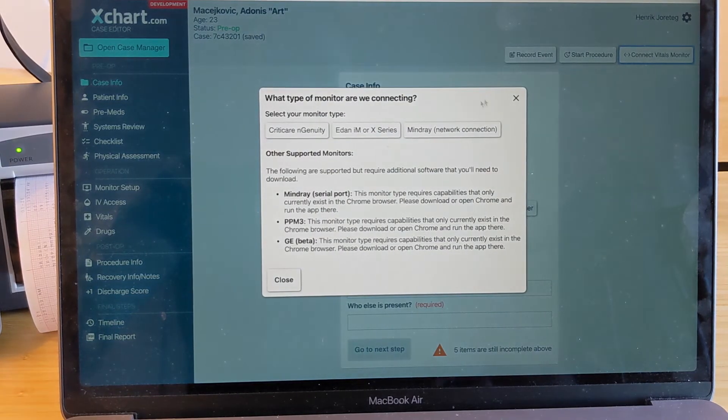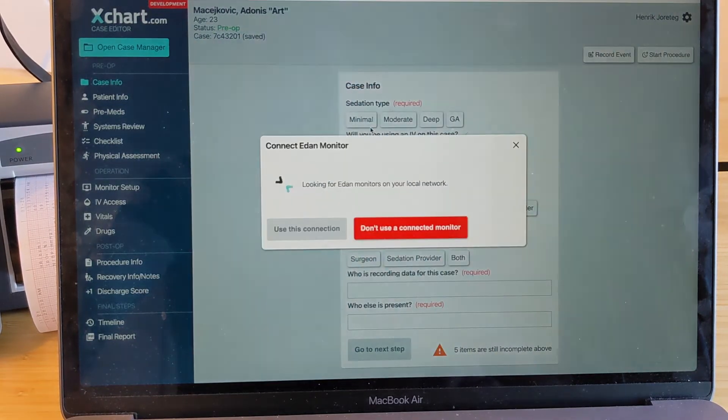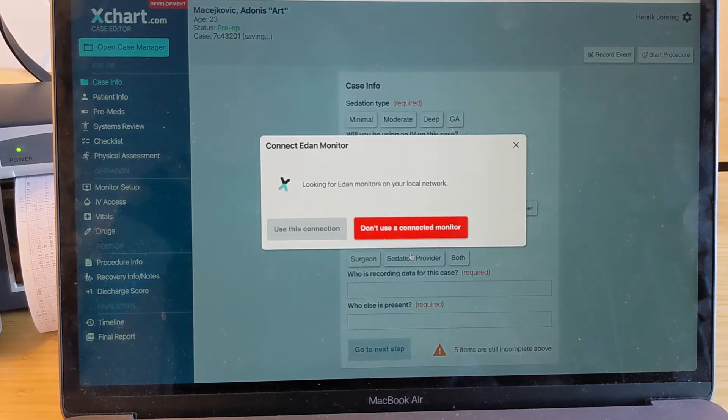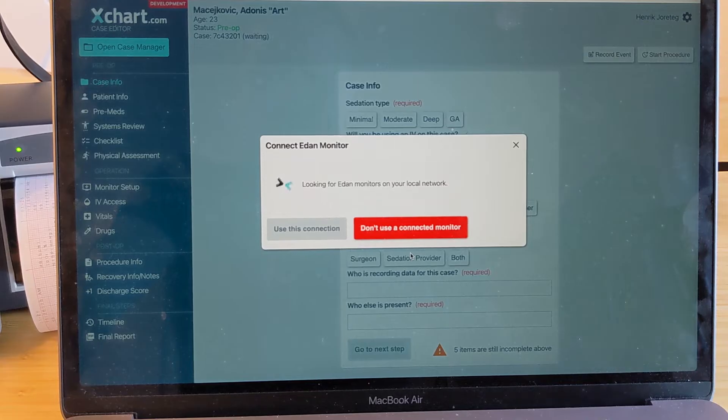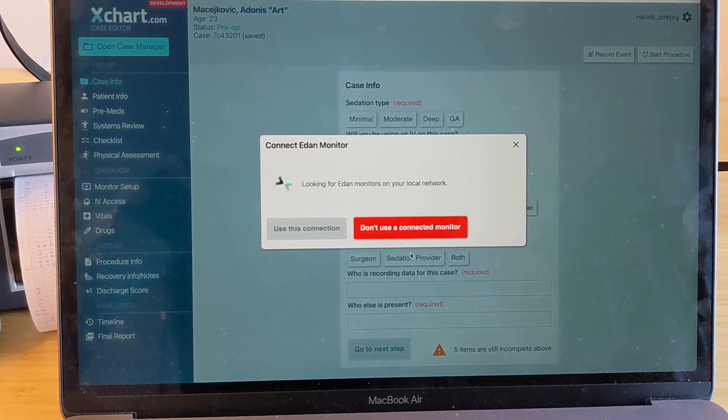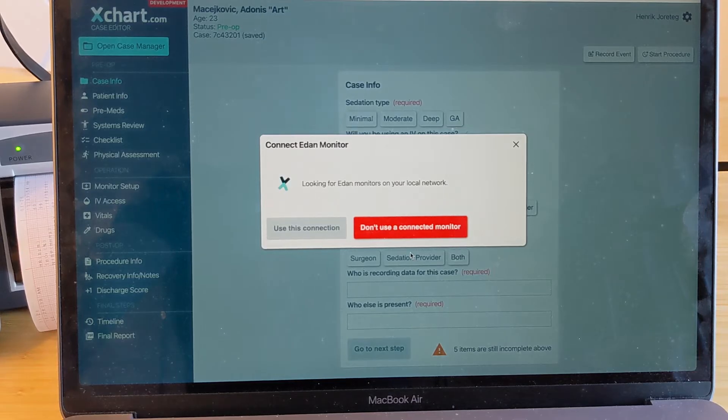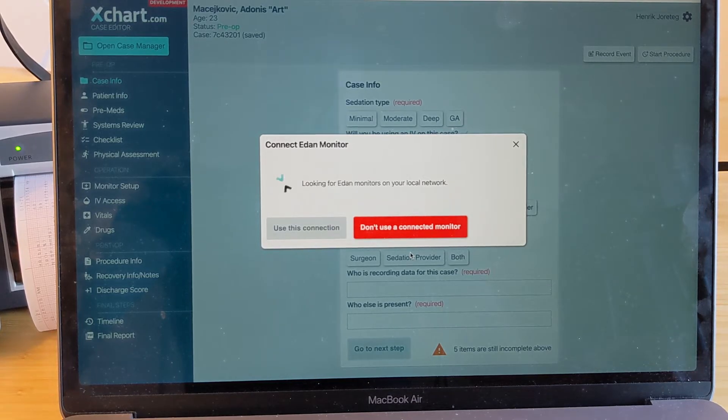And we're going to, of course, select the Eden series. And then it will start searching immediately for monitors on your local network. And this can take up to a minute. But it should find it.